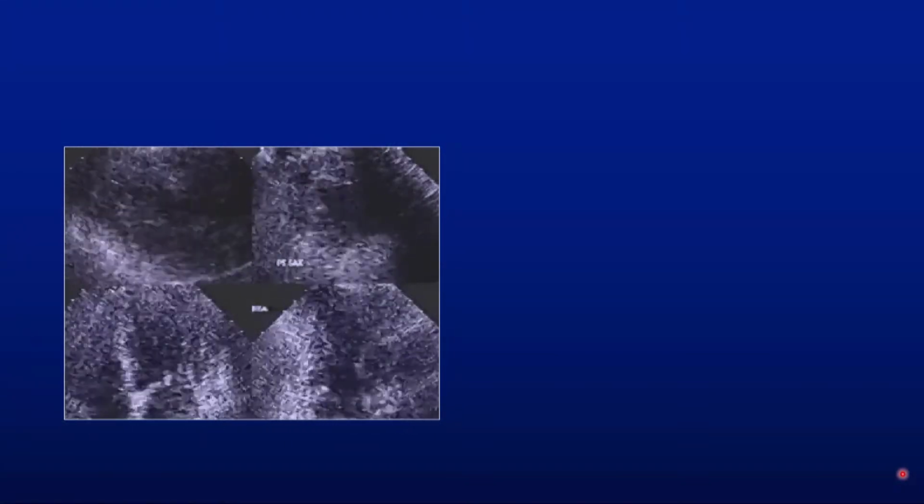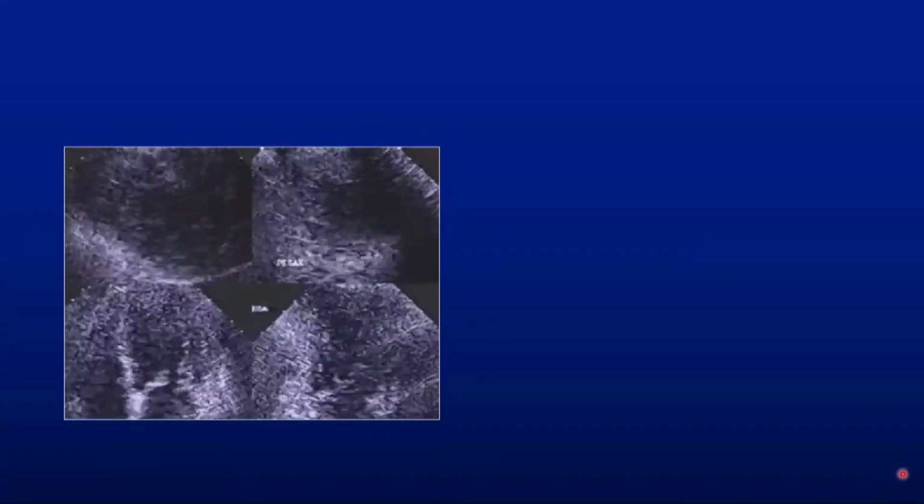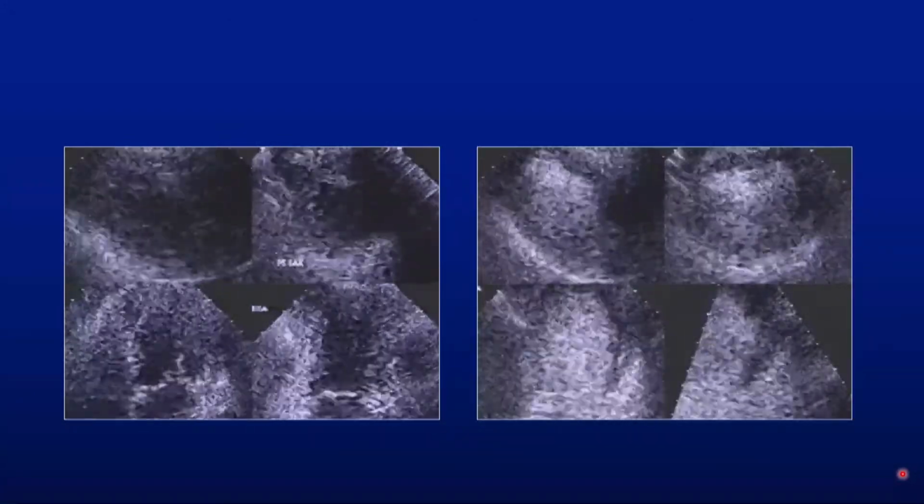And I love to show it, because the eye extrapolates. It's beautiful how the eye tricks you on things. I interpreted it as normal. So our friend Dr. Kleiman calls me up and said, how could this be normal? The EKG is so abnormal. There's an infarct somewhere. I said, Neil, I can't see it, but I'll bring the patient back and do a contrast echo. Okay, so we bring the patient back.